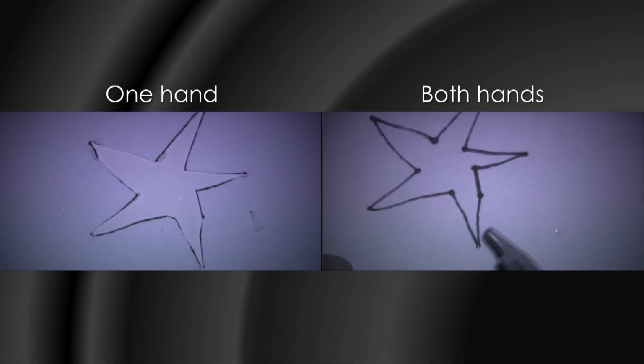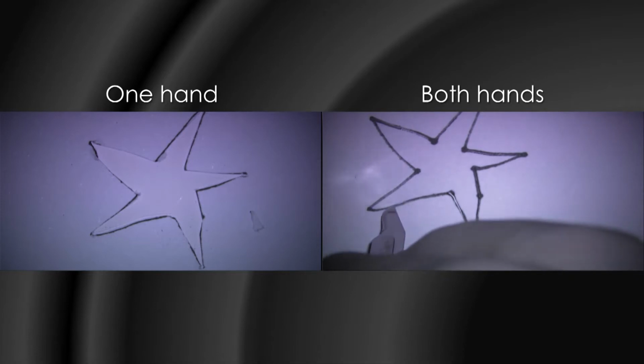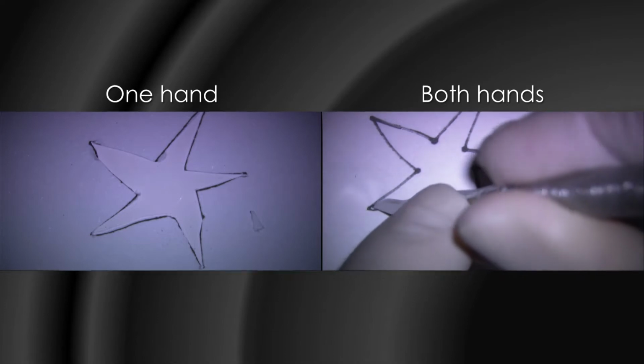This is both hands incision. I can control the 15C blade. As you can see, this is both hands treatment.